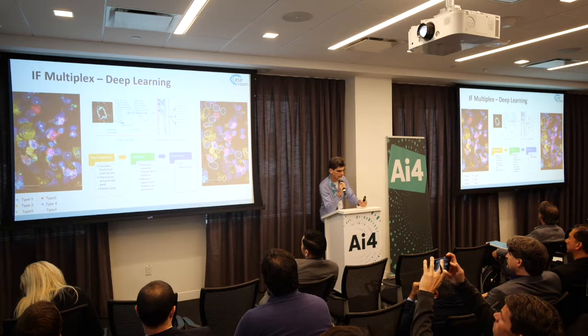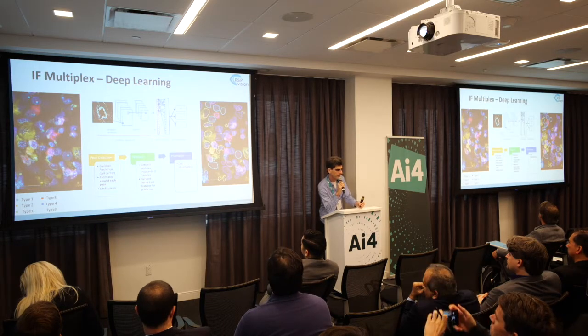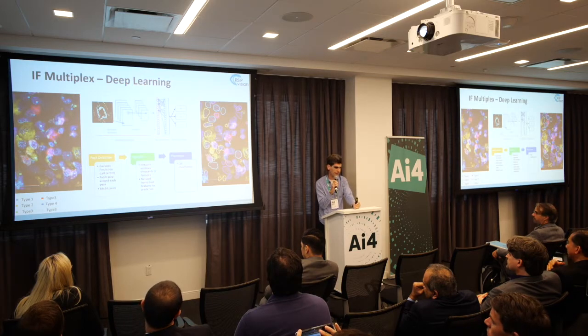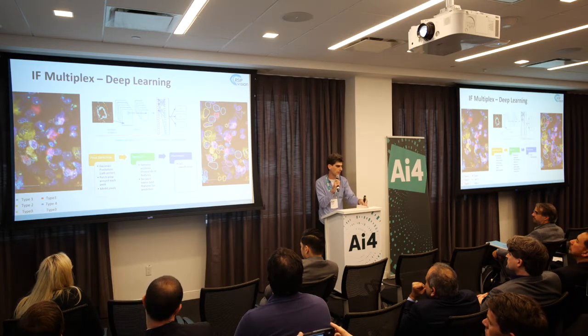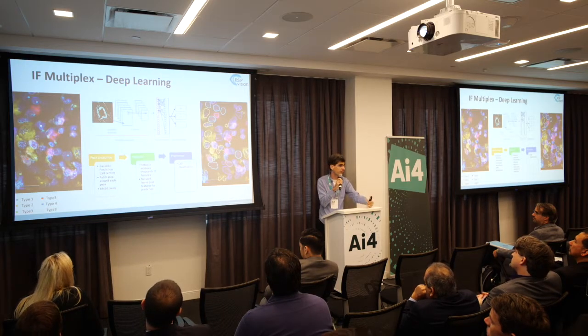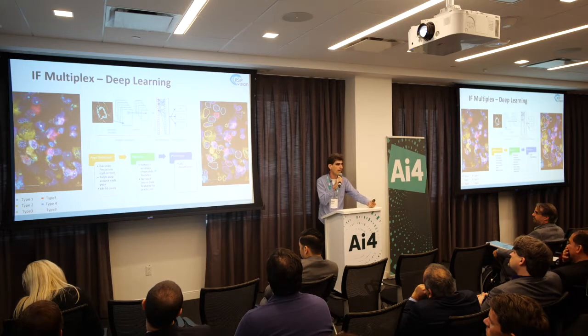So once you see where your network is failing, it's very important actually to understand these cases. It's not just a black box, because once you understand these cases, in your next training session, you can show the network more examples of the difficult cases. You can try to artificially create more examples of the things that the network is having trouble with.